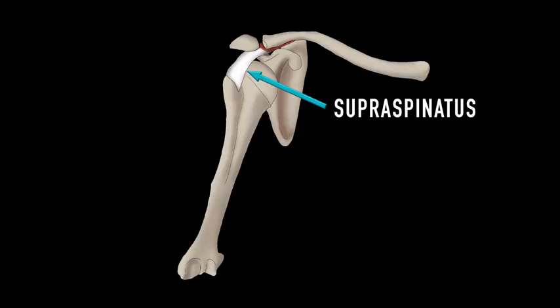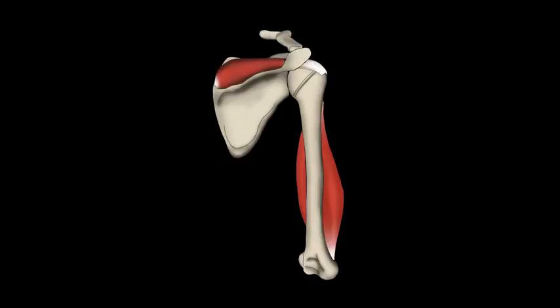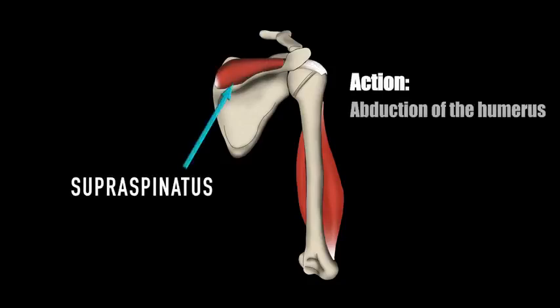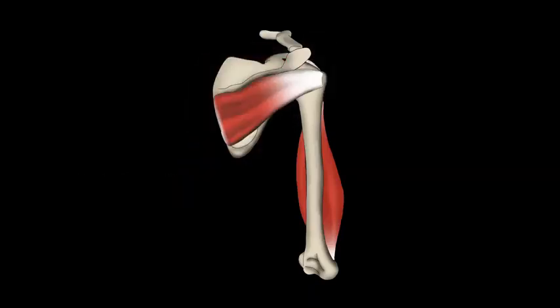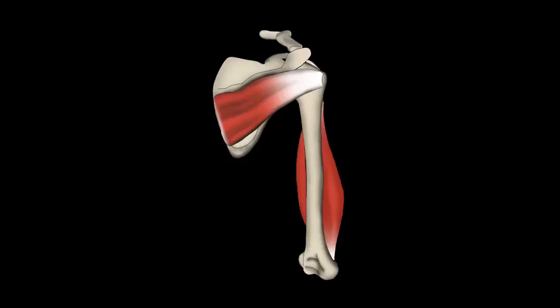The tendons of supra and infraspinatus can be seen from the front, but to demonstrate their anatomy it is best to view them from behind. The supraspinatus originates within the supraspinous fossa of the scapula, and its tendons insert onto the superior facet of the greater tubercle. The infraspinatus originates within the infraspinous fossa of the scapula and inserts onto the middle facet of the greater tuberosity.